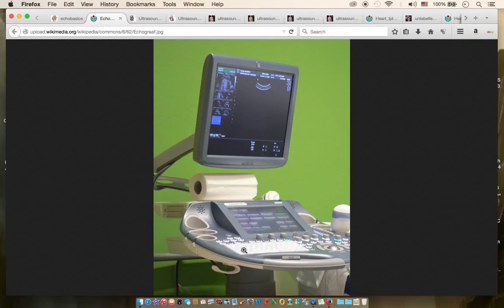It is very important to know the axes of echocardiography, because if you know the axes very well, you know how to reach the heart structures, right atrium, right ventricle, left atrium, left ventricle, even the aorta, and see any abnormality there.